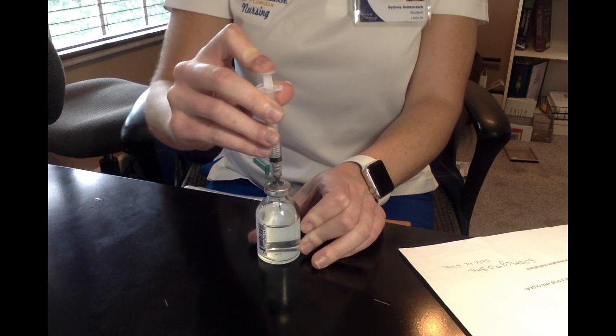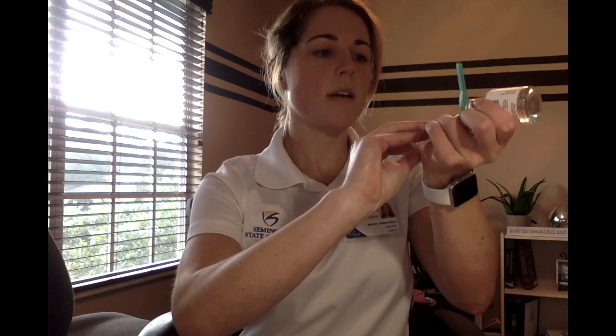And then you're going to flip it around, and you want to be careful when doing this. You don't want to bend the needle. So again, you're going to flip it upside down, and you're going to have it at eye level, and you're not going to touch the plunger. And you're going to aspirate 0.5 mLs at eye level, okay? Okay, and then we would discard of that in the popper bin.